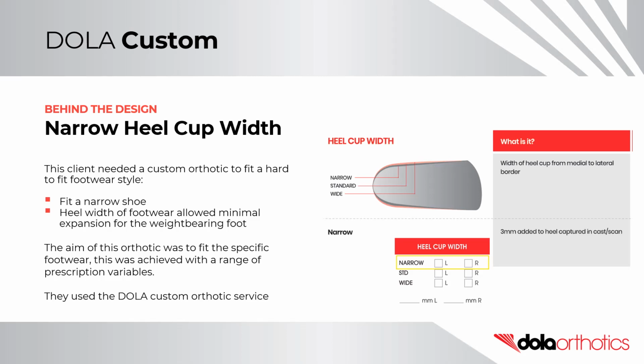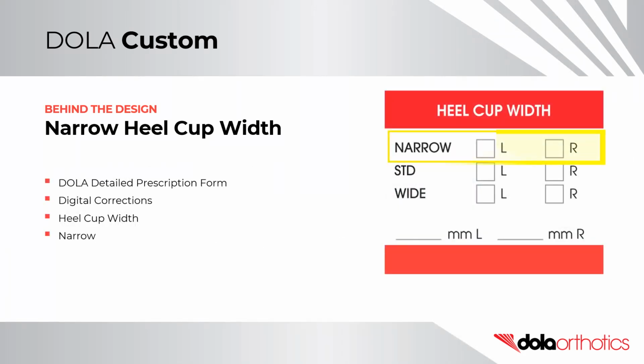The aim of this orthotic was to fit the specific footwear. This was achieved with a combination of prescription variables. They used the DOLA custom orthotic service. They selected the narrow option from the heel cup width options within digital corrections on the DOLA detailed prescription form.